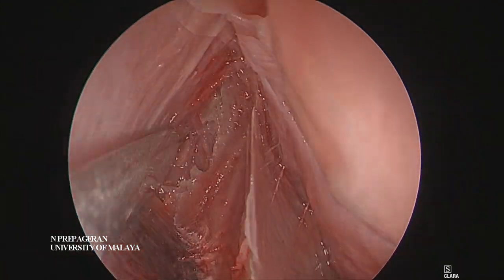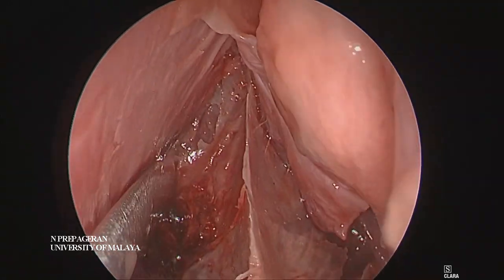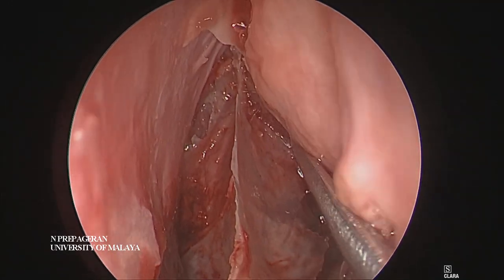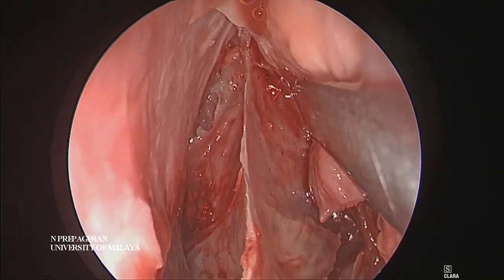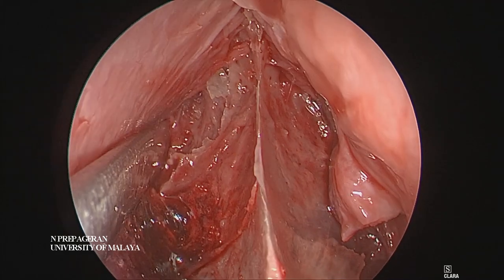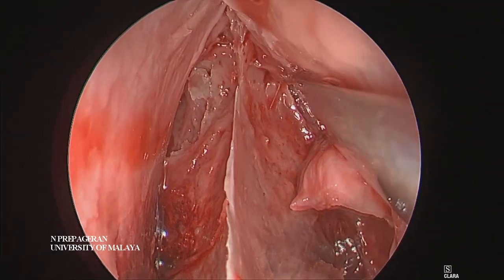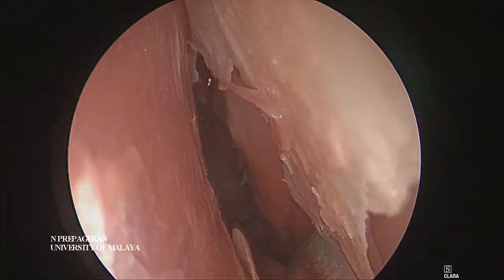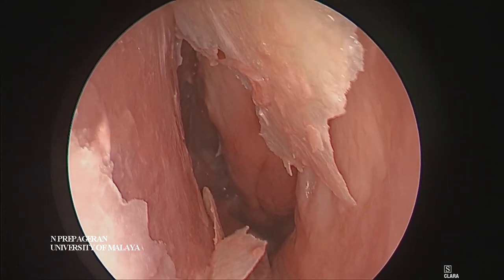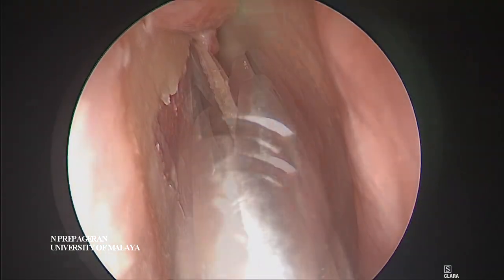This is the keel, and there's the sphenoid sinus on the opposite side. This gives us the pathway to do a transseptal sphenoidotomy. You can see the keel on the right with the ostia on the right, and the keel on the left with the sphenoid ostia on the left. The septoplasty has been done and we have a much better airway as far as this side is concerned.